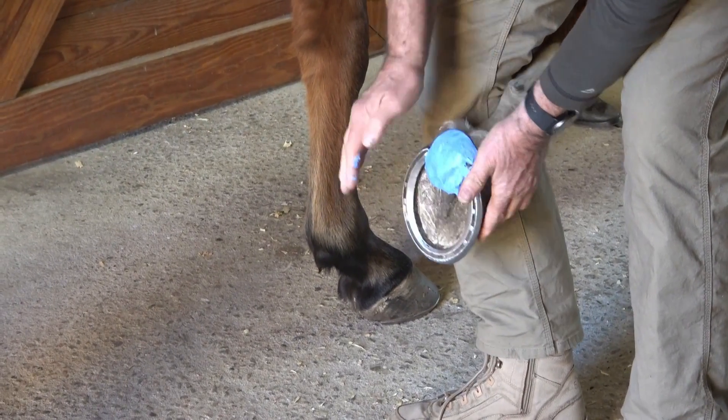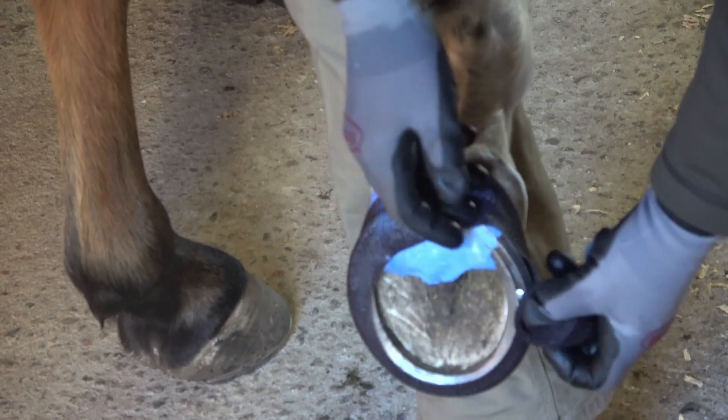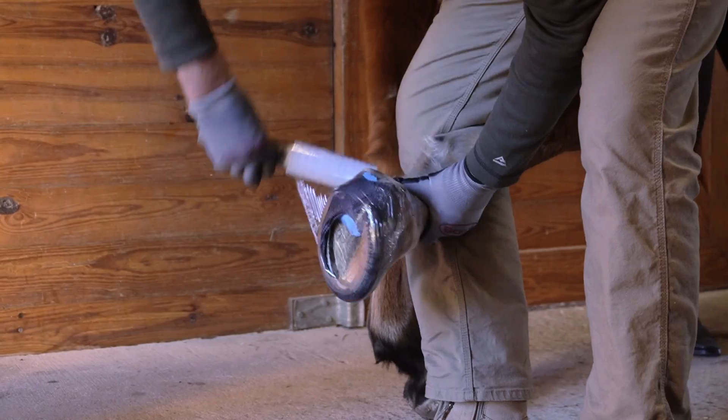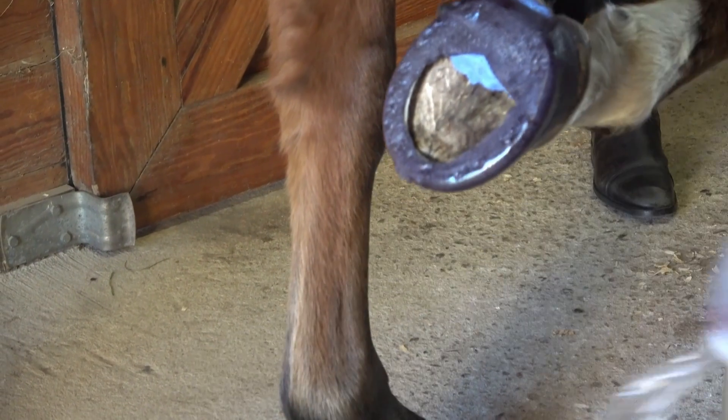Have you ever wanted the option to add some frog support after a shoe is already on or partway through a shoeing cycle? Casting is a great option for adding caudal foot support and stability to a shod foot at any time during the shoeing period. Stick with us as we cover a few options and techniques.